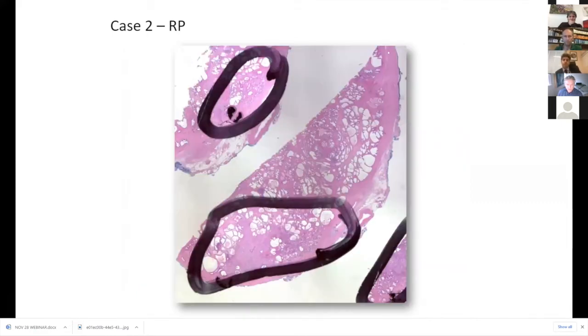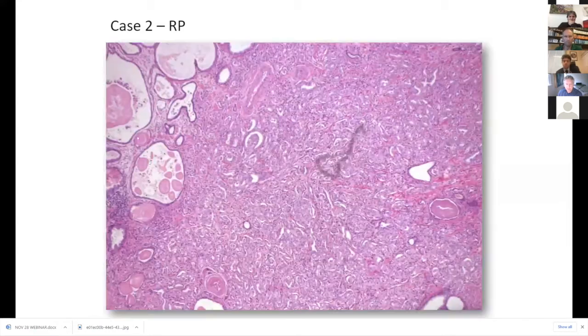This is the low power. These are the parasagittal sections of the apex. And so our lesion, that index lesion, is down in here. You can see benign glands even on low power. And then this more cellular area, and on zooming in on that, you can see these larger dilated benign glands, closely packed glands, glomeruloid structures, fused glands. So this is the pattern 4 component.